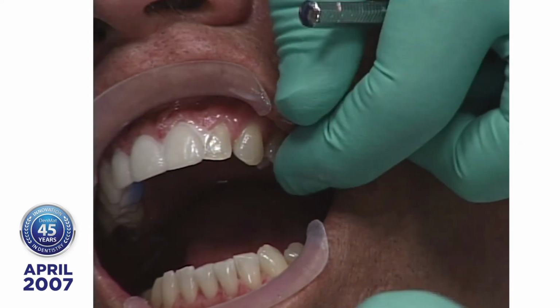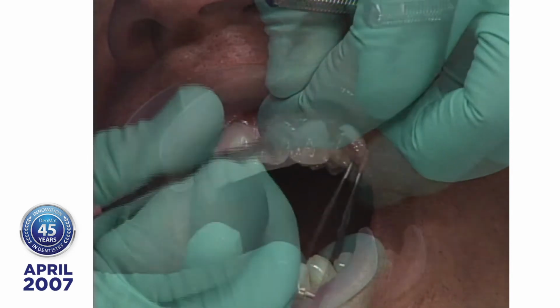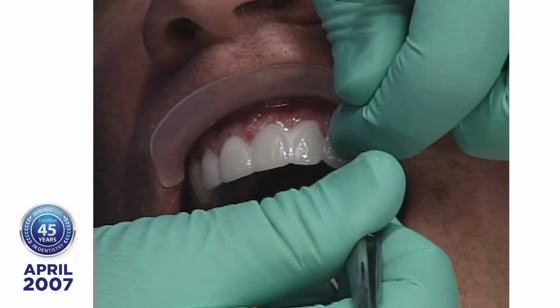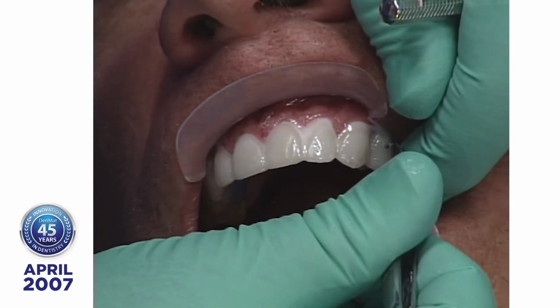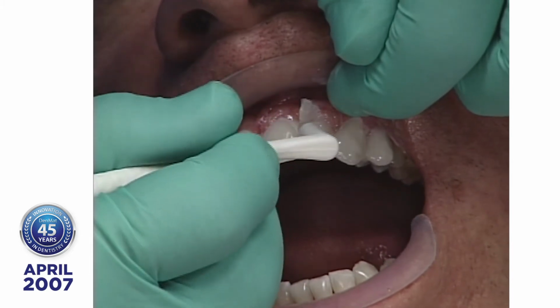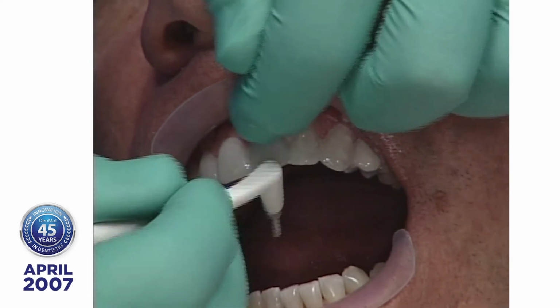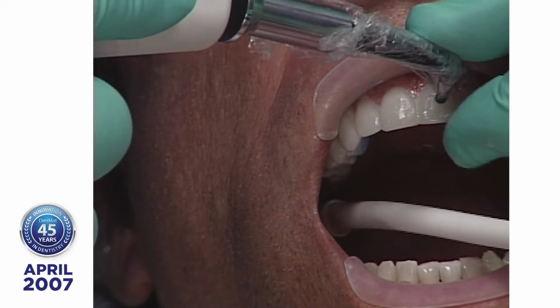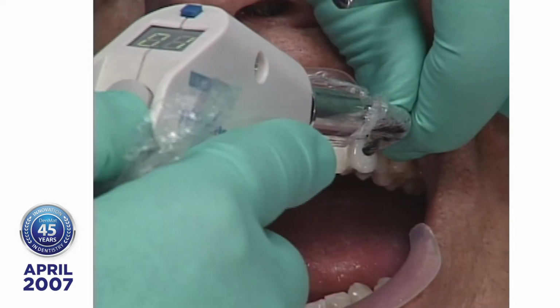Now we go to the left side and place these, left lateral. Okay. And you need to have everything dry, gently in place. And we always stay 1 tooth distal to where we're spot curing. And the reason is we don't want to inadvertently cure the resin on the contact point. Close your eyes.